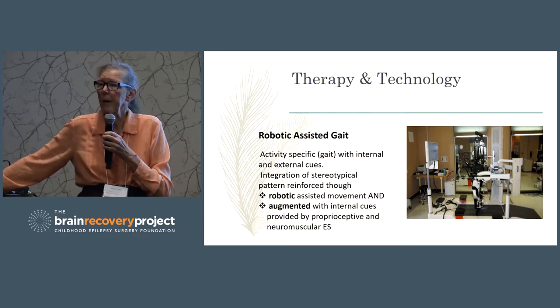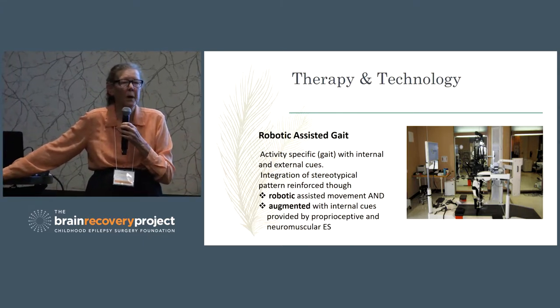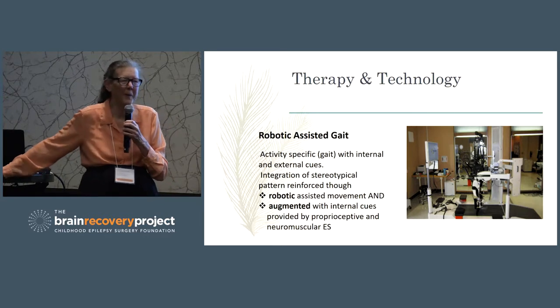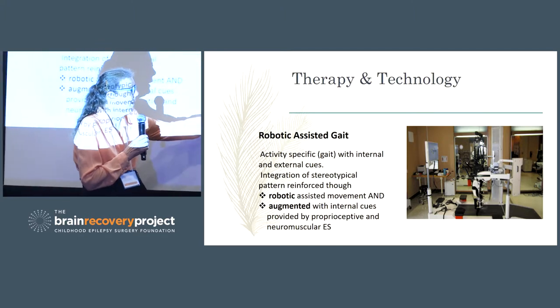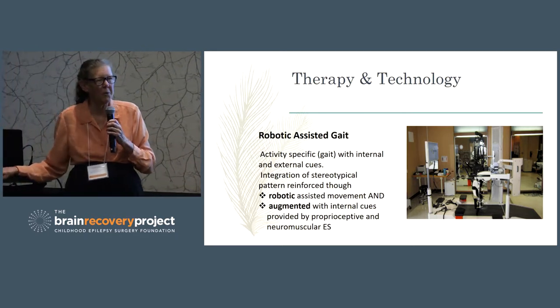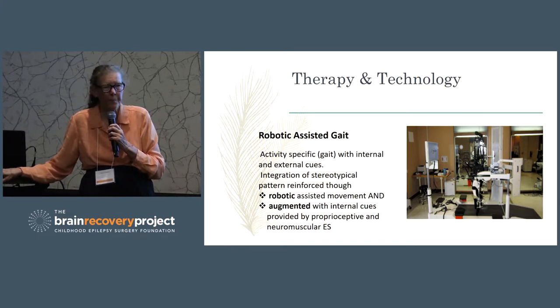If we don't have them work with it, then they're not getting enough sensory information to make it work. I've had therapists tell me, well, I don't like them to work with it because then they get out of plane and I have to stop and restart again. Okay, work that out. Having them not work with it is not a very effective treatment. But with a channel of dorsiflexion and a channel of knee extension, this could be a very powerful treatment, and it has been, but you've got to be careful. You have to watch who's doing it, because sometimes they're not doing it quite the way you would like. Okay?